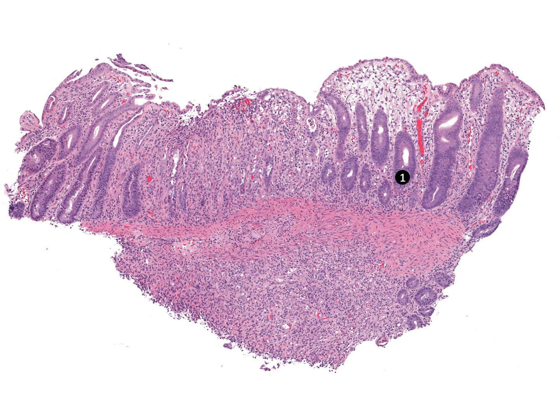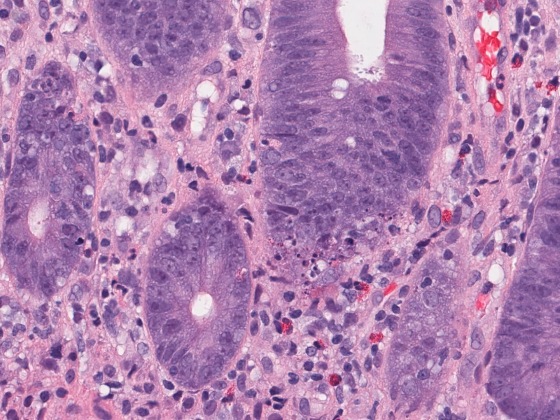The diagnosis of graft-versus-host disease requires the presence of crypt apoptosis. Here, apoptotic bodies are seen in almost every crypt.